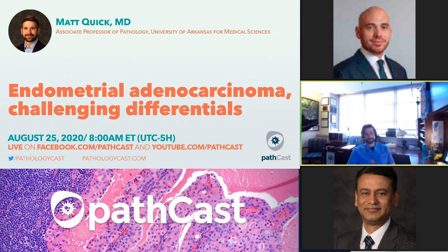Now, cytologically, there's not much you can do. That cytology doesn't help. Usually, they tend to be bland. So I want you to look at the architecture whenever you're faced with a case of a metaplasia. Mucin is very common. So a mucinous metaplasia, for example, look at the overall architecture. Go to low power. If the area of mucinous metaplasia that you're seeing is complex, and if it stands out from the background endometrium, I would argue that you're at least dealing with a mucinous EIN or a mucinous adenocarcinoma.